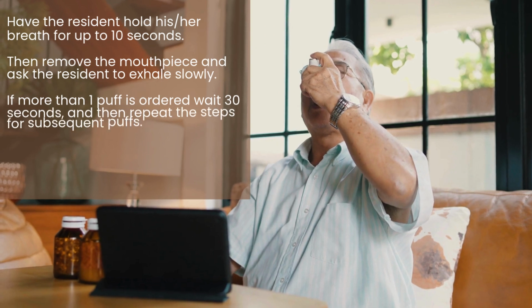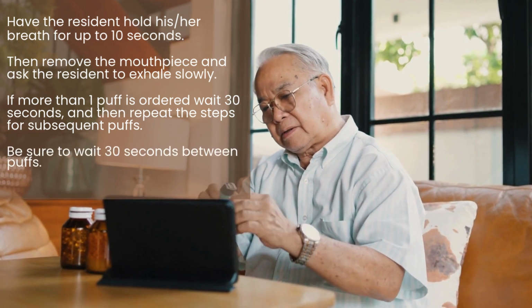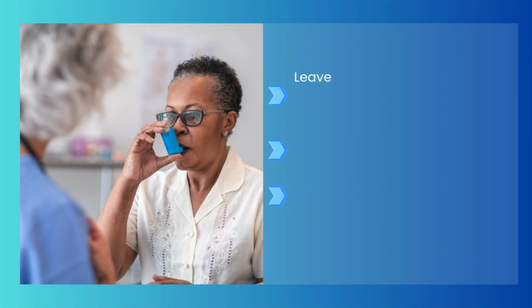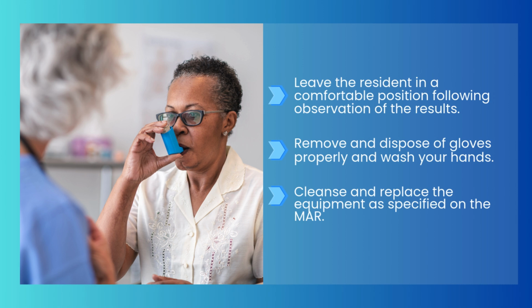If more than one puff is ordered, wait 30 seconds and then repeat the steps for subsequent puffs. Be sure to wait 30 seconds between puffs. Leave the resident in a comfortable position following observation of the results. Remove and dispose of gloves properly and wash your hands. Then cleanse and replace the equipment as specified on the medication administration record.